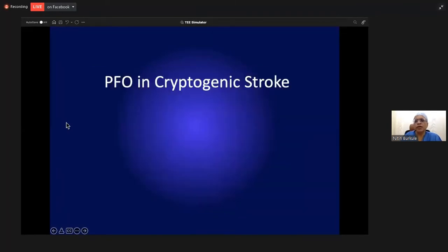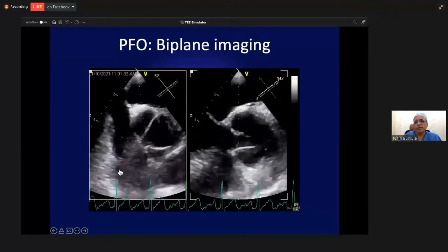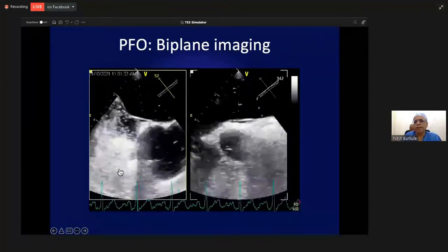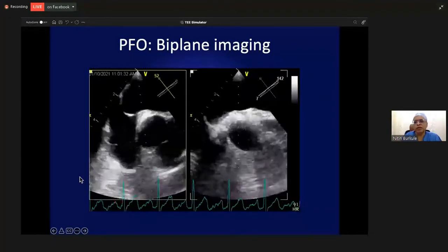In cryptogenic strokes, when you have seen the arch of the aorta properly and ruled out that there are no plaques there, and the LA appendage has no clots, you can look at the saline bubble contrast with Valsalva. You can see in this patient that the septum now bows towards the LA and the PFO literally opens up and there is a good amount of right to left shunt. This is a very large right to left shunt with the Valsalva maneuver.